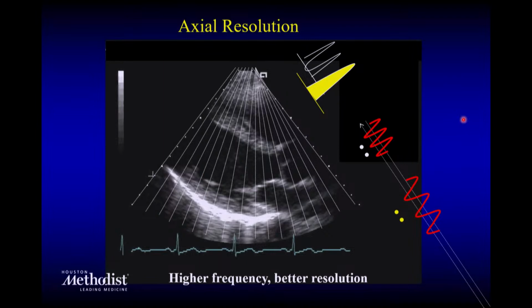sonographer, or person, irrespective of using, is the difference between axial resolution and lateral resolution. This is very important. Remember one thing. Axial is you're hitting the structure rather perpendicular, okay? And lateral is the differences between these two dots, if they were in the lateral portion. Always in ultrasound, the axial resolution is better than lateral resolution. So therefore, if I want to image a structure, better to be perpendicular to it for me to have the best resolution. Let's take an example here.